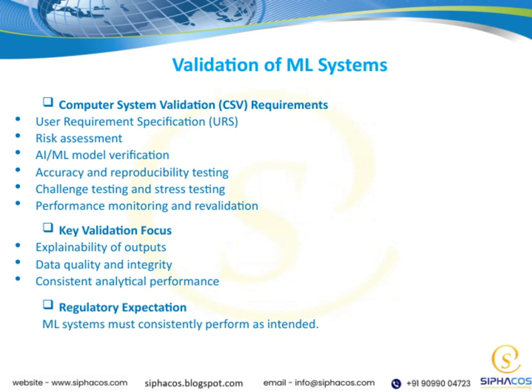Next, we move into AI and ML model verification, ensuring that the models work as intended. Accuracy and reproducibility testing are crucial here. They confirm that the system produces correct results consistently. Challenge testing and stress testing push the system to its limits, helping us understand how it performs under extreme conditions. Finally, ongoing performance monitoring and revalidation are necessary to maintain trust in the system over time.